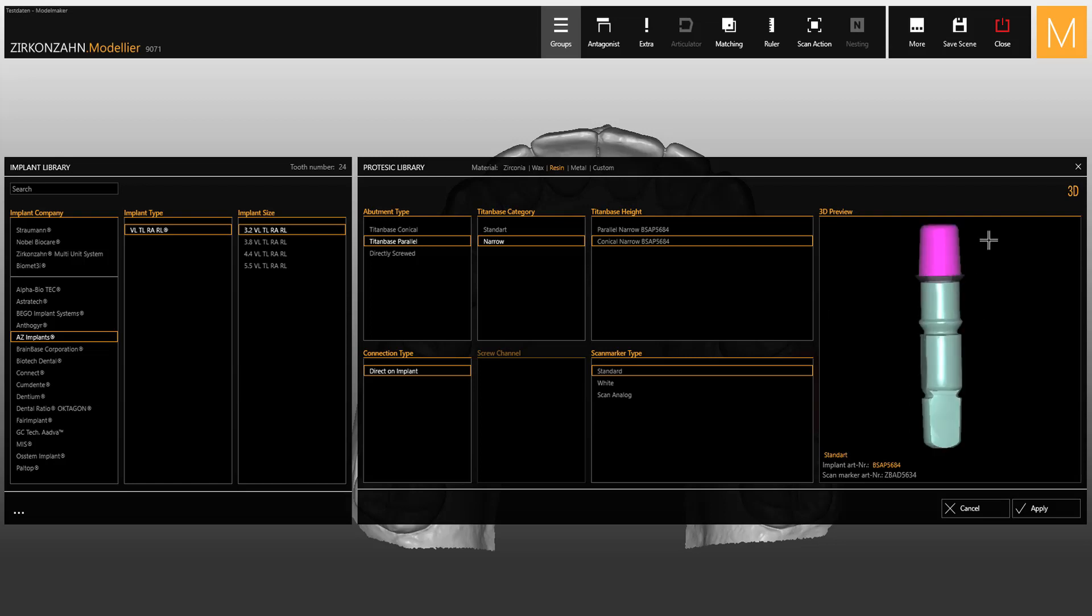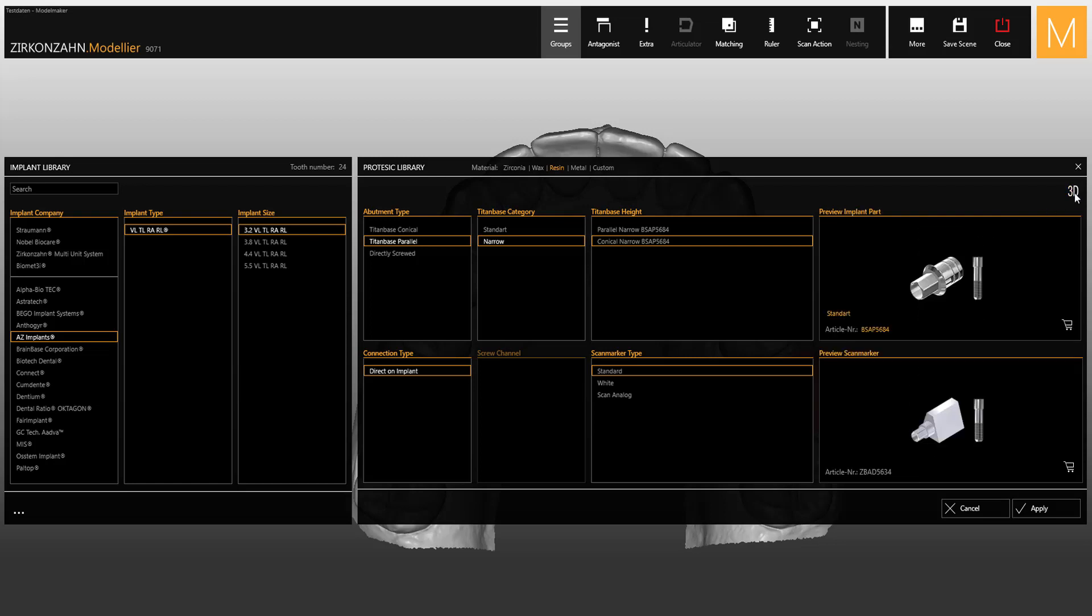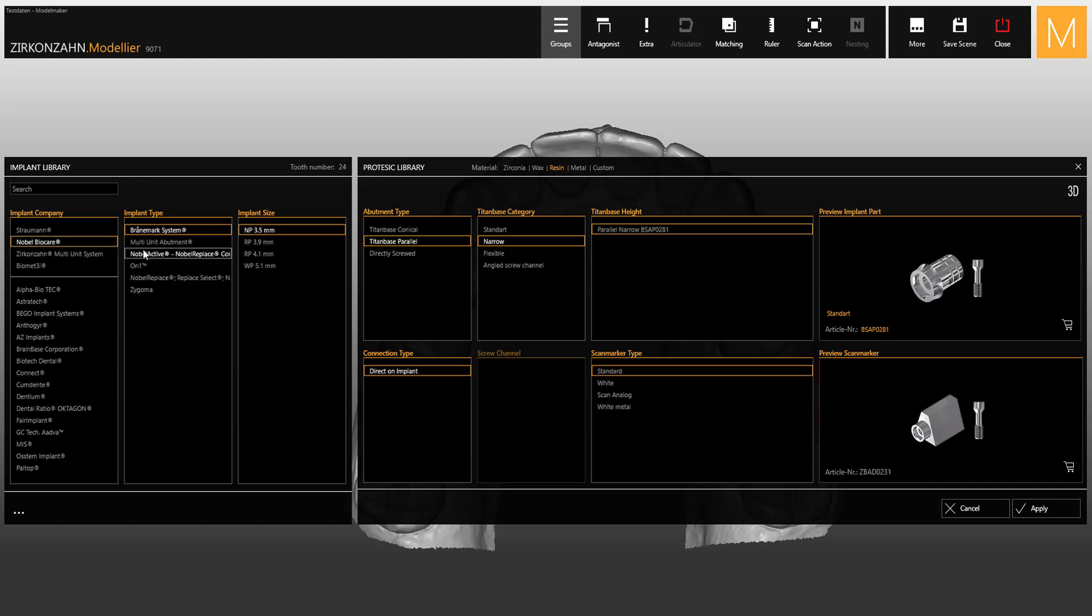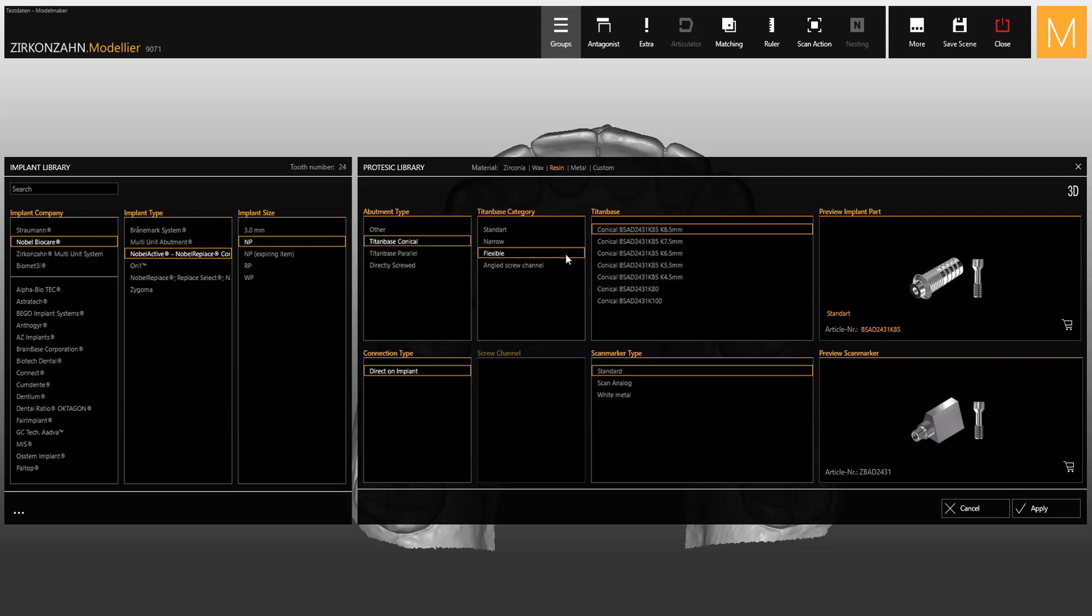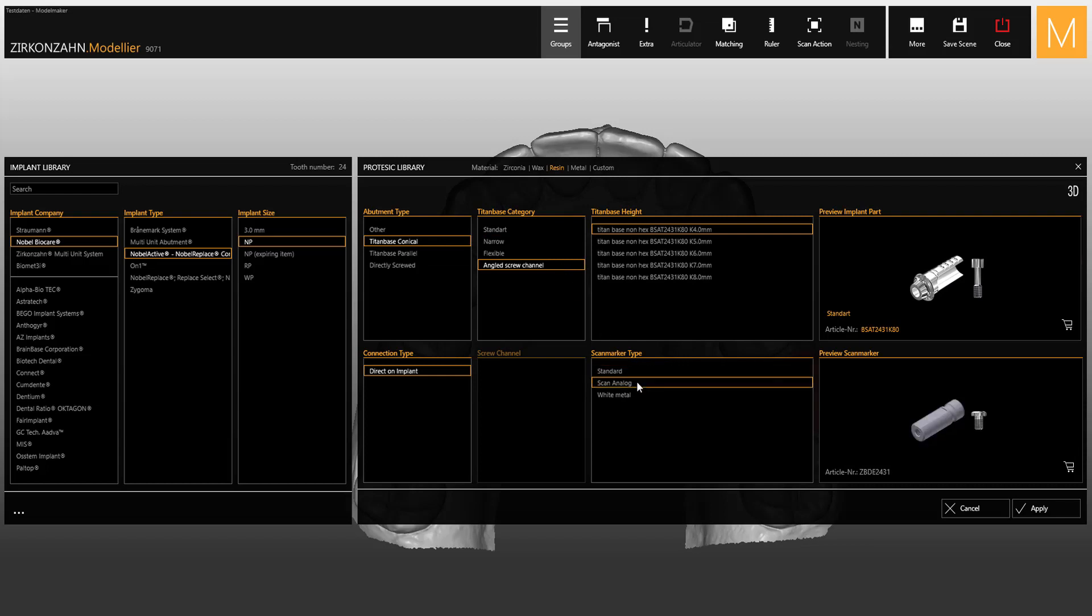As you can see, everything is clearly structured and divided into different categories where you can easily select the required titanium bases, such as the new titanium bases K85 and K80, and their respective scan body types.